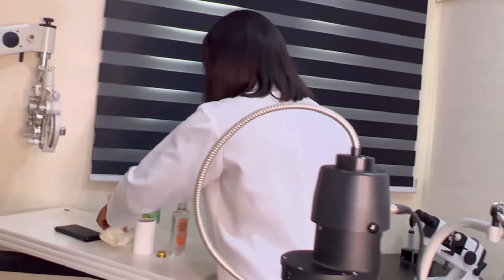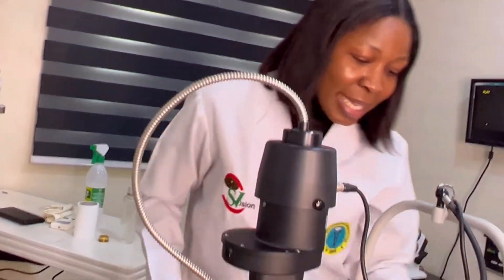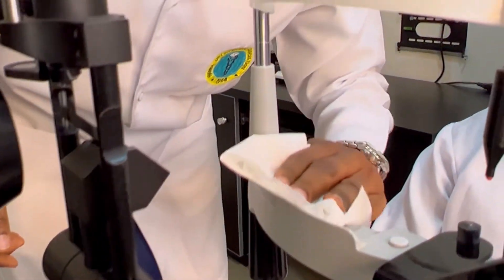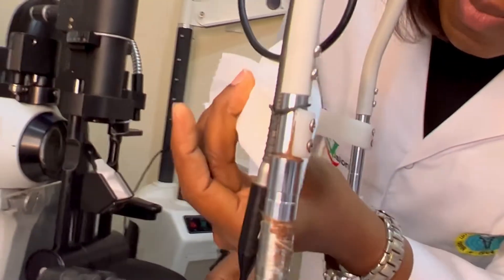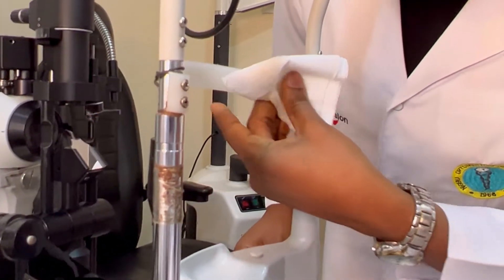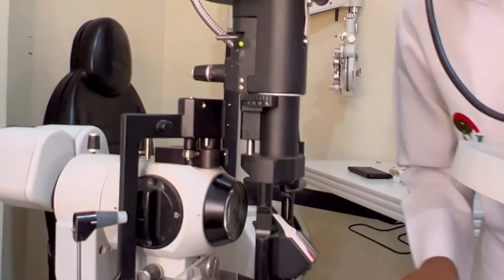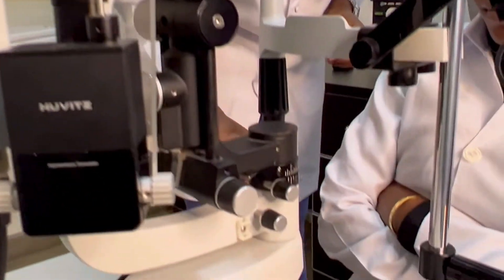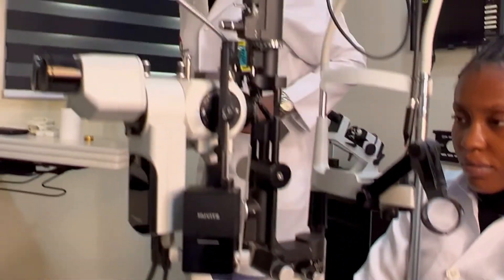Please do this in front of your patient in the consulting room. I'm going to be sanitizing the chin rest, the forehead rest, and the hand rest. Remember, please do not use a cloth — use a wipe or tissue because you need to dispose of it after each patient use. So you take your spirit and gently clean up the chin rest, then gently clean the forehead rest in front of your patient. Next, gently clean up the hand rest. This helps to boost their confidence in you — it shows their general health matters to you as an eye doctor.